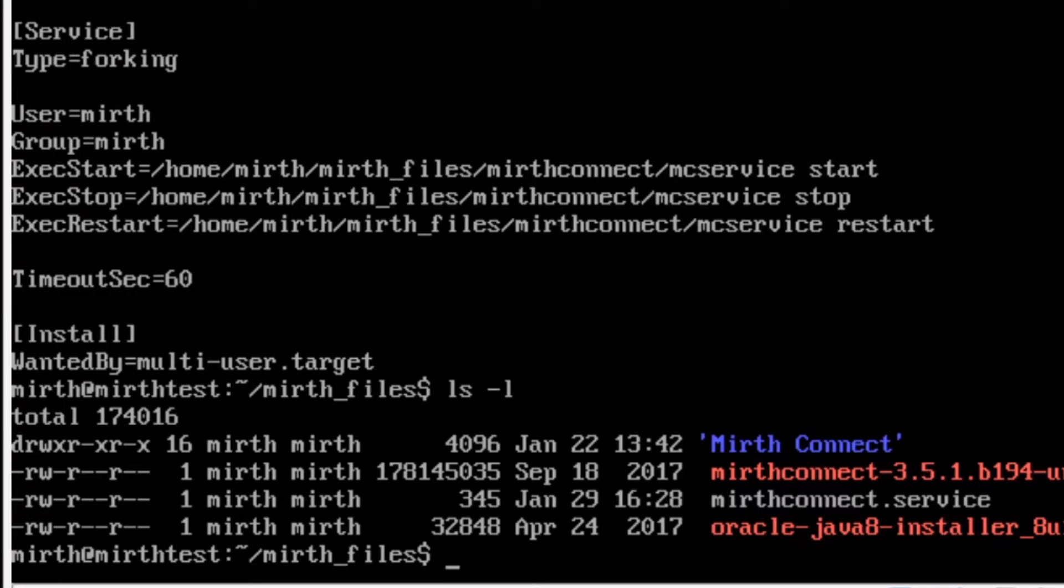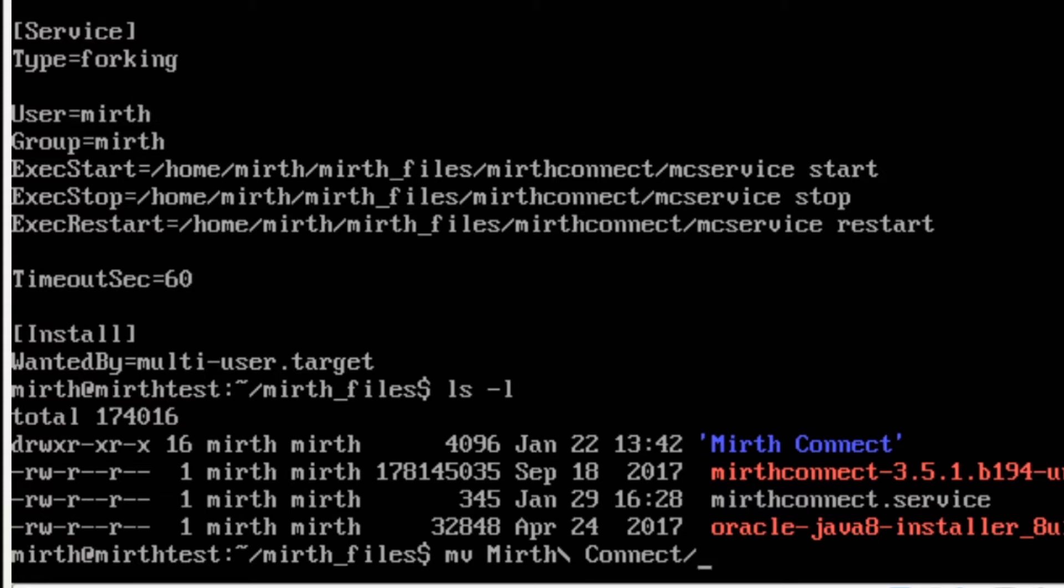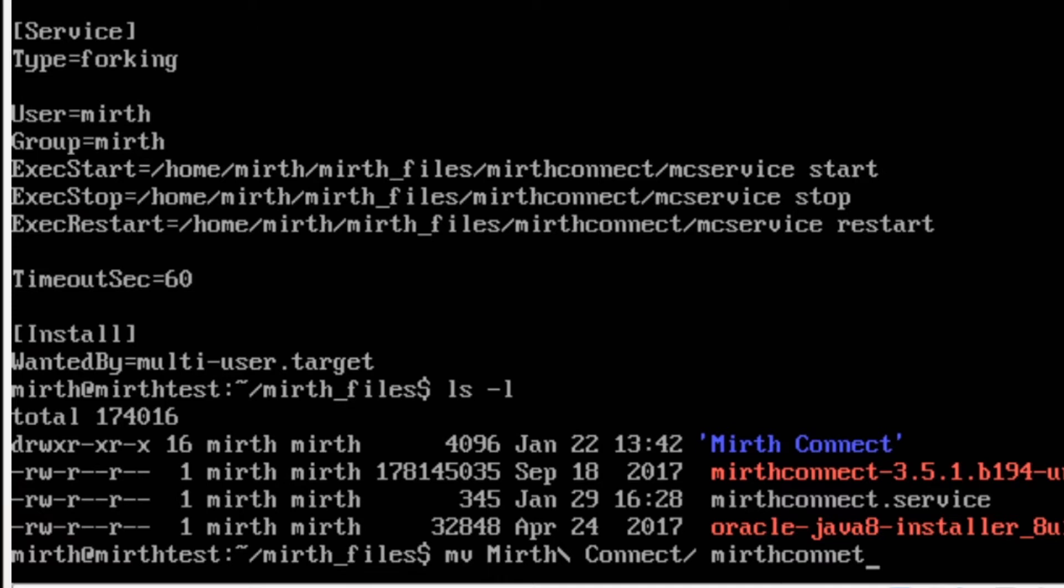So we want to MV move. MV stands for move. And then capital M press tab. It should autocomplete to MIRTH Connect with the escape characters in place for the spaces. I'm going to hit space and then rename it as mirth connect. No spaces, all lowercase.